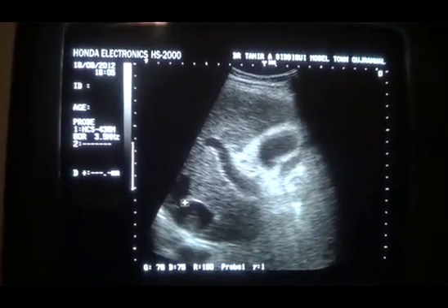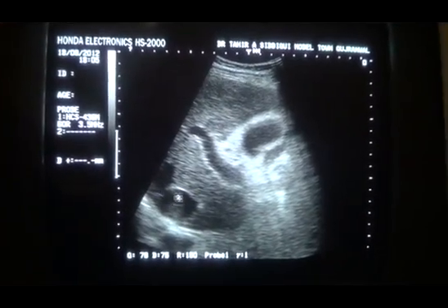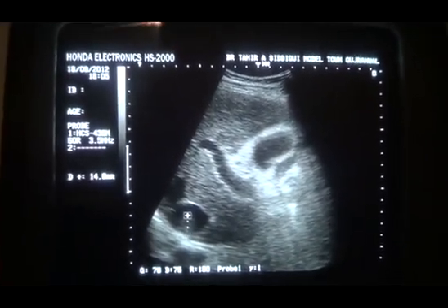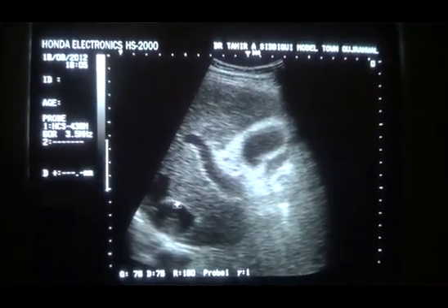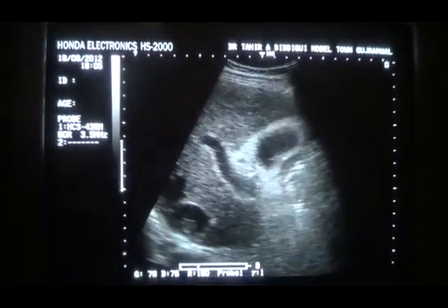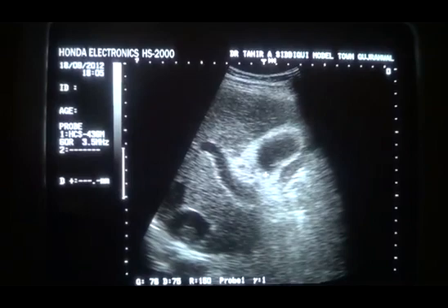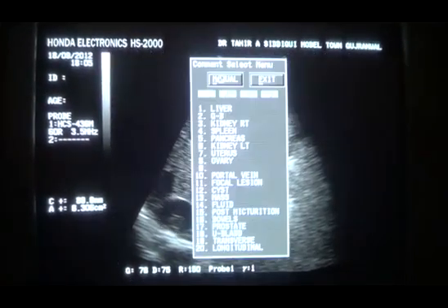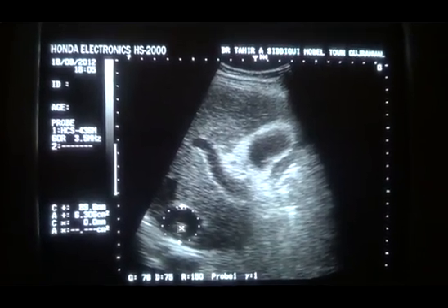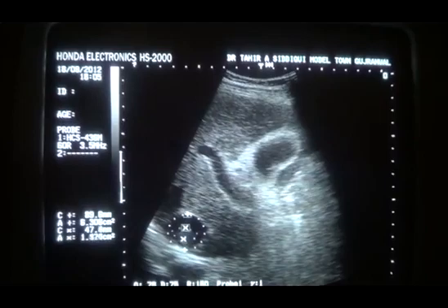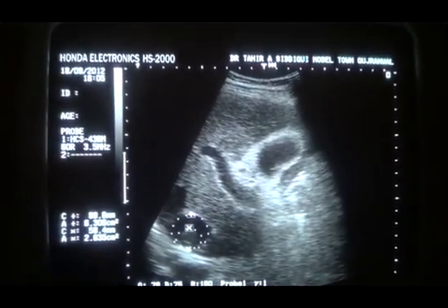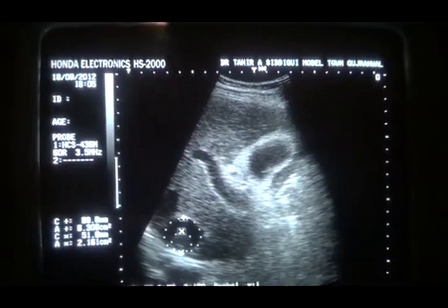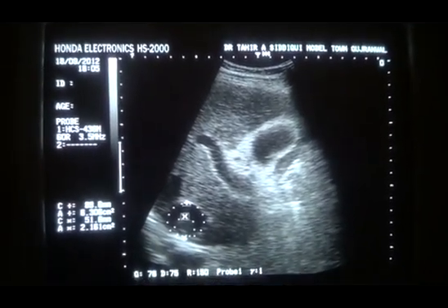Now this is the inferior vena cava. This is the portal vein, the IVC, and you can see an echogenic area within the IVC measuring approximately 14 millimeters. This is the inferior vena cava in cross-section, and this area is a clot formation within the IVC. This area is evenly echogenic and is suggestive of clot formation in the inferior vena cava in transverse section.